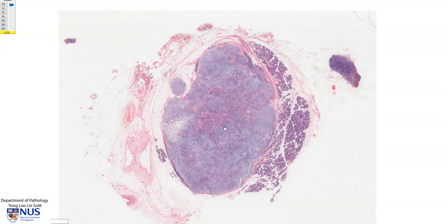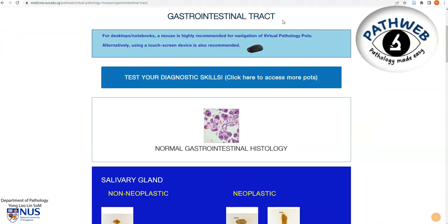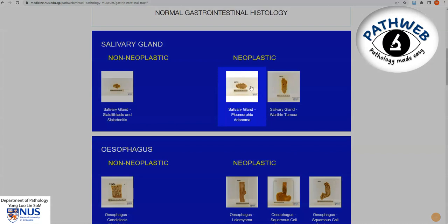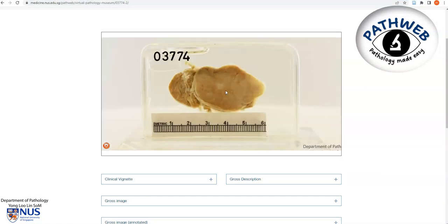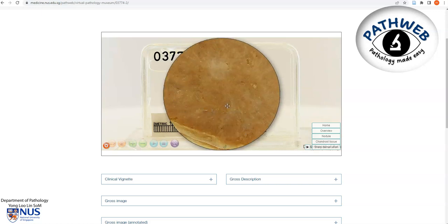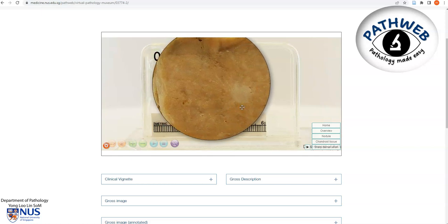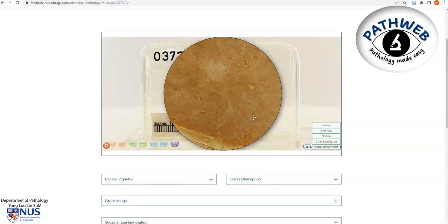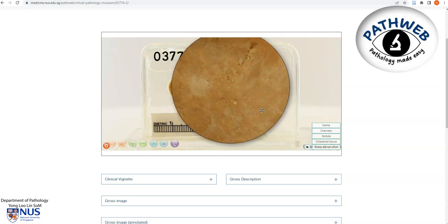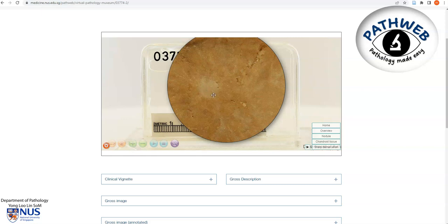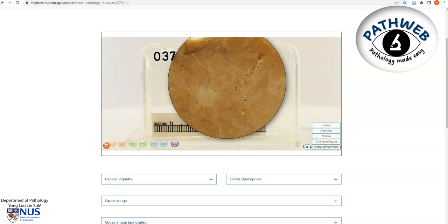Let's have a quick look at the gross appearance. I am in the gastrointestinal tract chapter of our online virtual pathology museum and I'll click on the pleomorphic adenoma icon. Here is the virtual specimen. The tumour is very sharply demarcated, and this is the lobulated appearance of the normal salivary gland parenchyma. As we look into the tumour, we can see it has a slightly heterogeneous cut surface; some of the paler, whiter areas are likely to represent areas richer in the chondroid matrix.